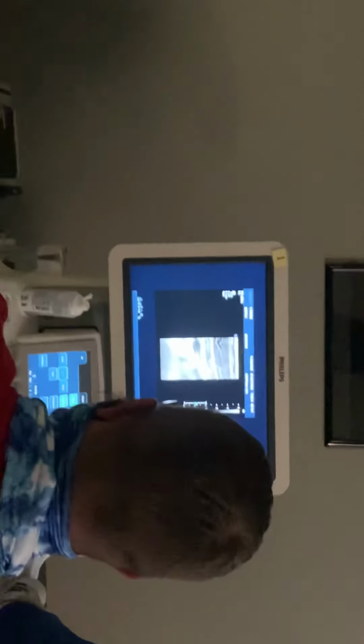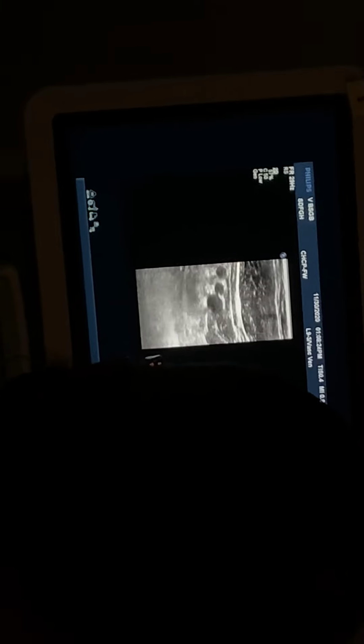So you see her subclavian is right here. See where it splits? What vessel is that coming off of it? Thinking arteries. See this vessel coming off right here? What vein is that? Axillary? It's actually the cephalic, which runs out here and dumps in that way. Okay.